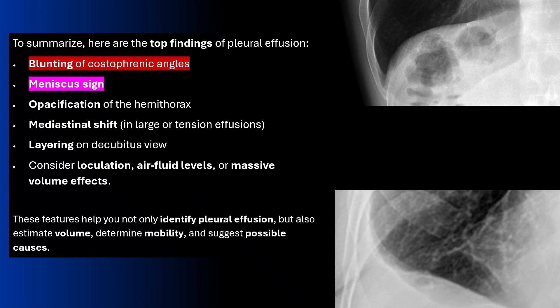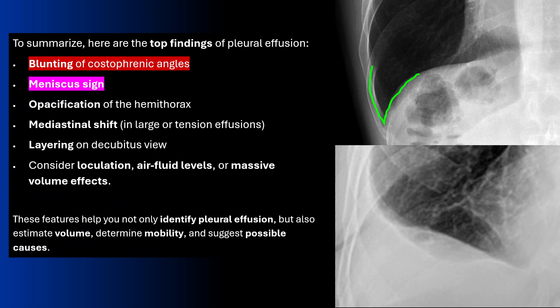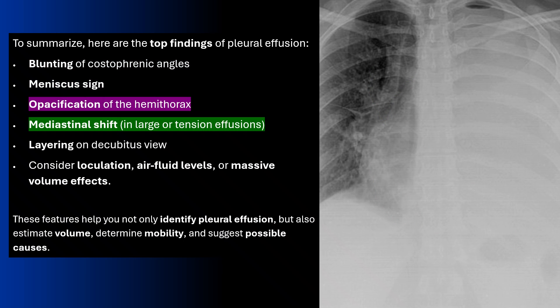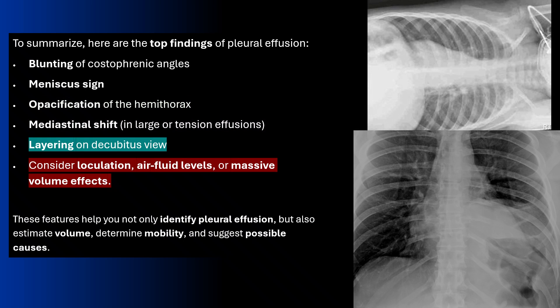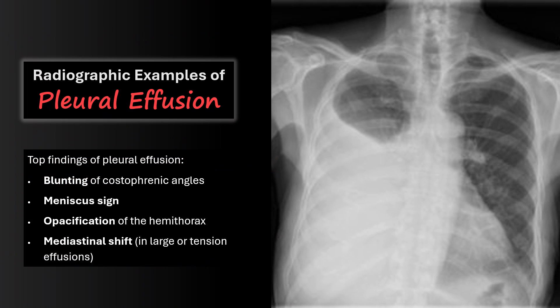To summarize, the top findings of pleural effusion are: first, blunting of the costophrenic angle; second, the meniscus sign with lateral tracking of fluid up the chest wall; third, opacification of the hemithorax with mediastinal shift away in large effusions; and fourth, layering on the lateral decubitus view. Don't forget the pitfalls — loculations that look like tumors, air-fluid levels, and massive volume effects. These features help identify the effusion, estimate volume, determine mobility, and suggest possible causes.